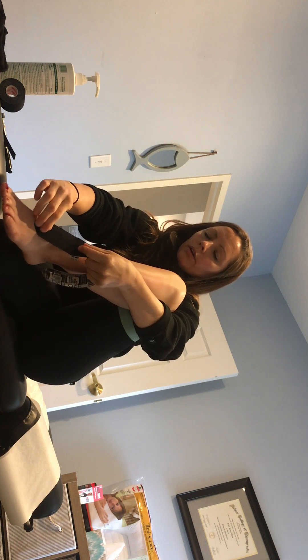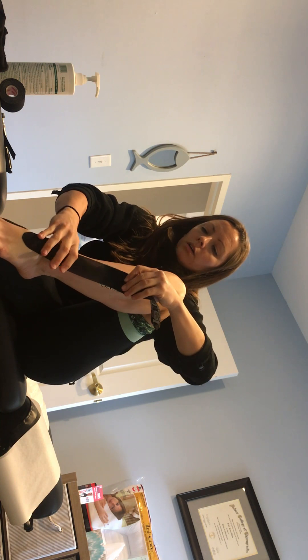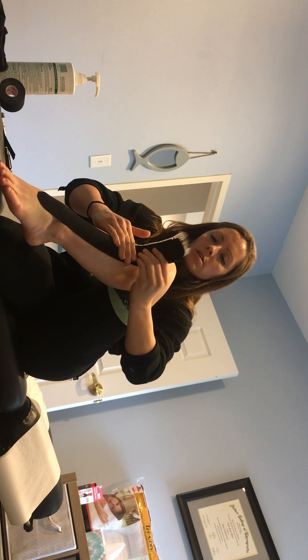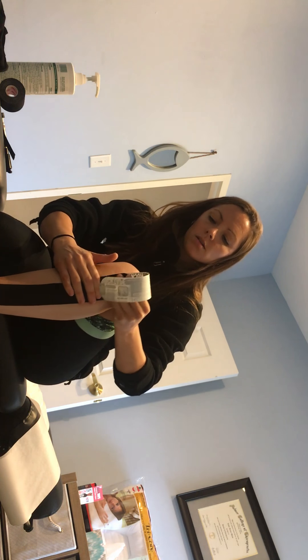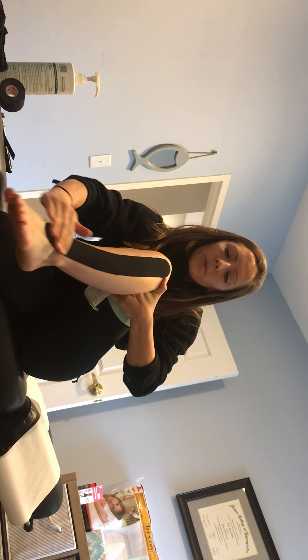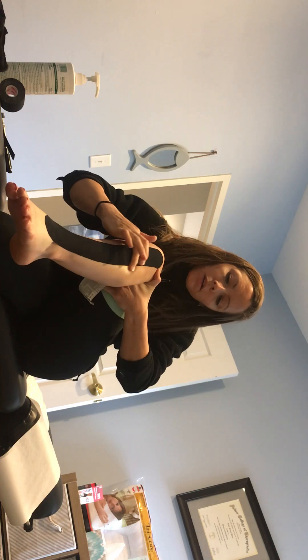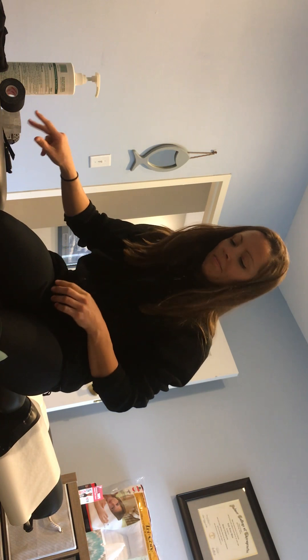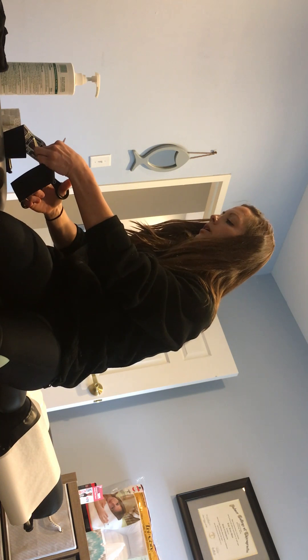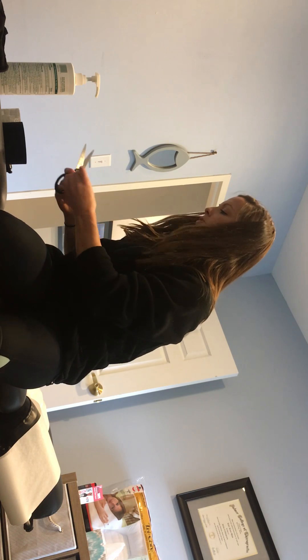So I'm going to go down through here and come through — fit some hold. Place it through there. That's actually a really good spot. It's not summertime yet so I won't have any funky tan lines, but it feels pretty good actually. I'm going to do one more just going across my knee joint to give it a little bit more support. Like I said, trying to run a 5K coming up, so I'm trying to get this knee ready.